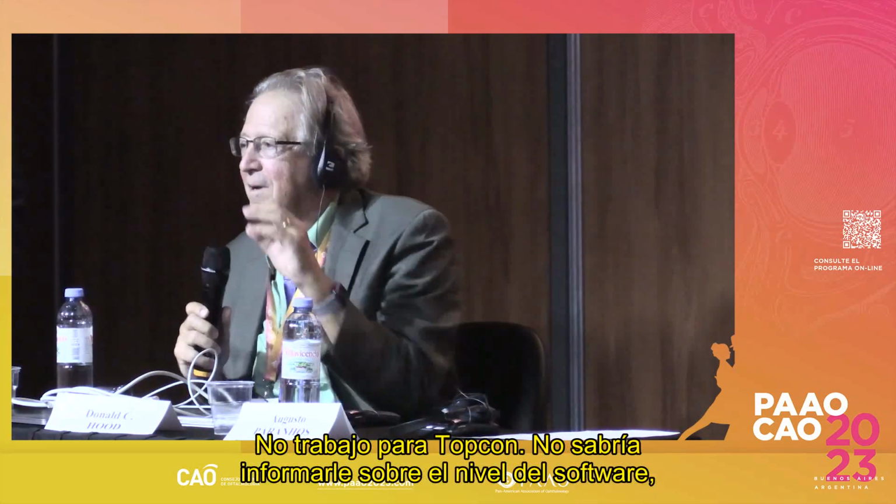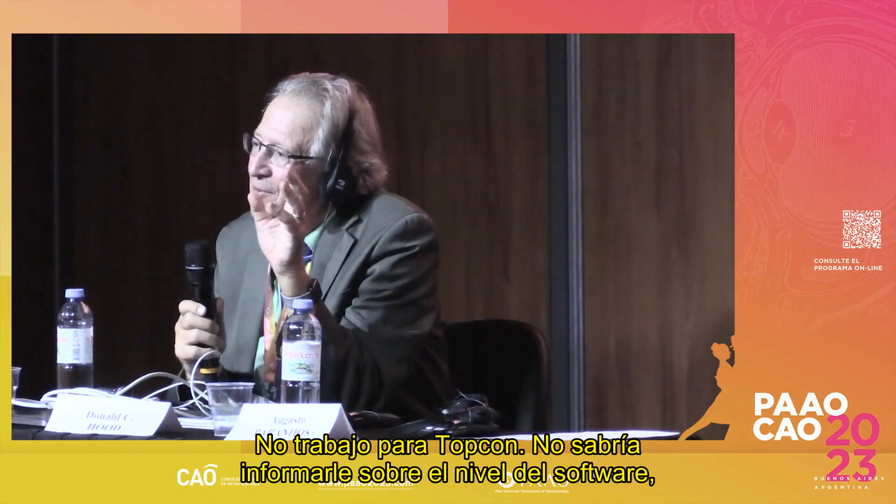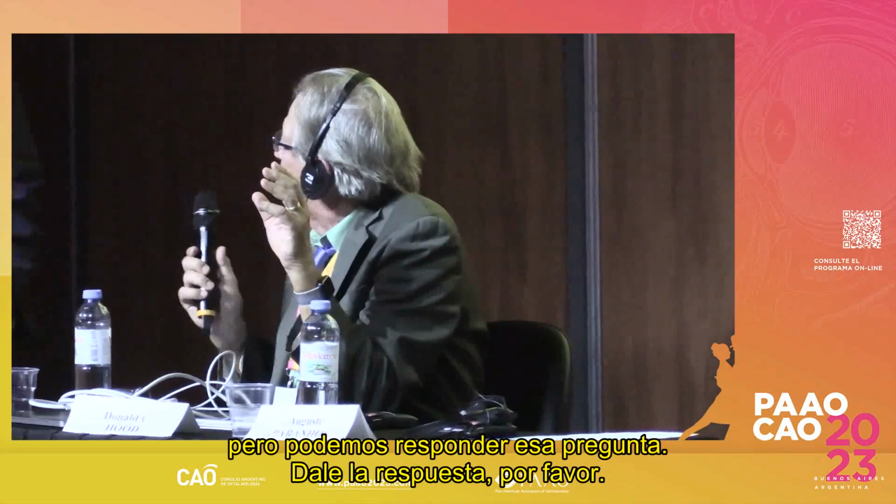I don't work for Topcon, and I'm not involved in that level of the software, but we can convey that question to other people, unless you know the answer to it.